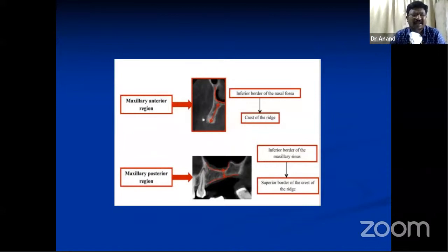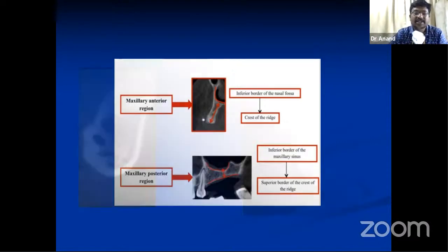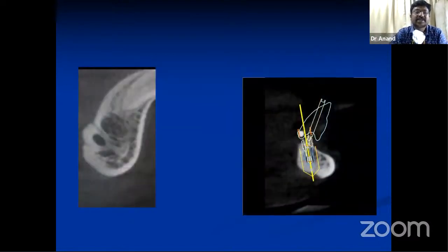In the anterior region, sometimes the lingual canal, or the lingual foramen, can also be a problem if it is of a larger size. Usually if it is a smaller size, you don't need to consider it. If it is a larger size and the implant encroaches the lingual foramen, you land up in a large hematoma. So these things have to be visualized properly. So here is a case of a lingual foramen which is very large in size. This is an abnormal variant of the lingual foramen where it is present in a larger size. If it is encroached, you land up in a larger hematoma.